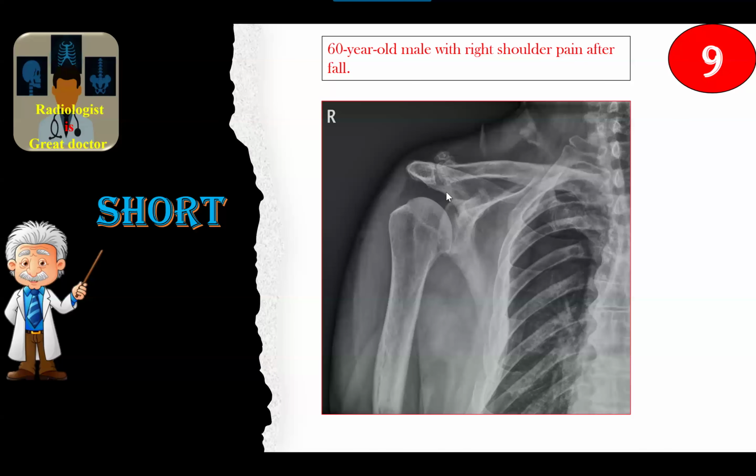So in summary, my friends, during your revision, please deal with each joint in this way. Traumatic conditions: dislocation, what could dislocate in the elbow, in the wrist, a common dislocation, for example in the wrist, lunate, perilunate with fracture or without fracture, metacarpals, fourth and fifth, interphalangeal joints, even the distal radio-ulnar joint.